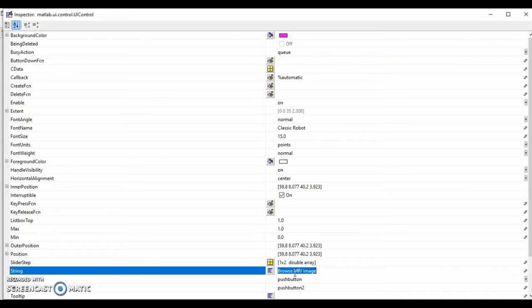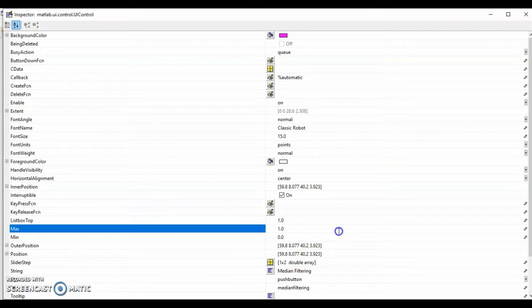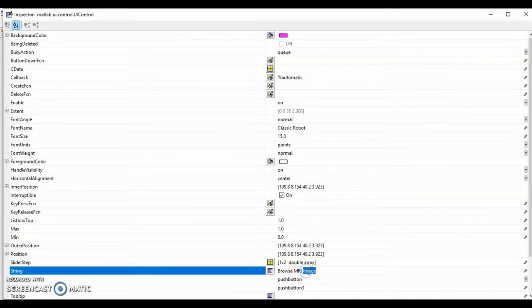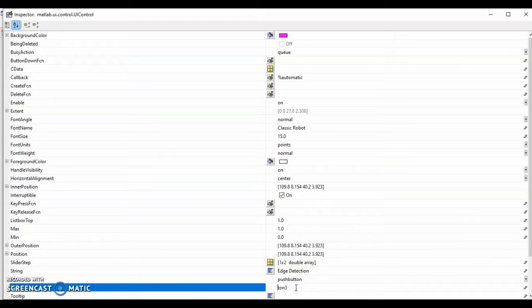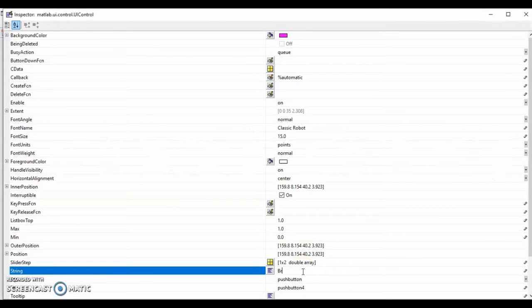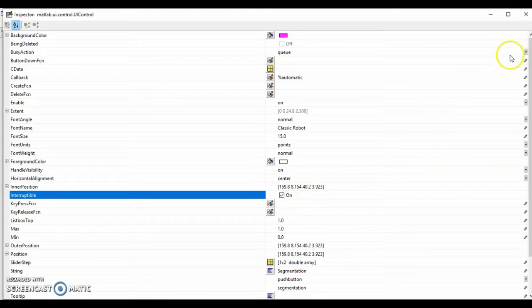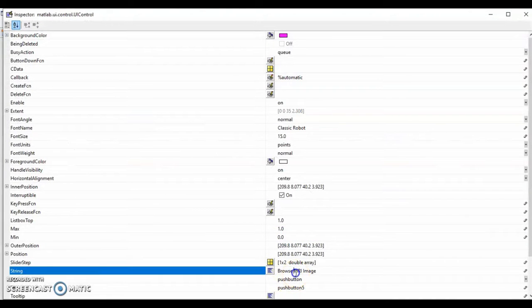So the second function will be median filtering, and therefore we will change the title of the second push button to median filtering. And not to forget to change the tag also. And we will change the third push button to edge detection. This is the same for the tag. And next, we will change the fourth push button to segmentation. And finally, we will change the last push button to tumor detection.